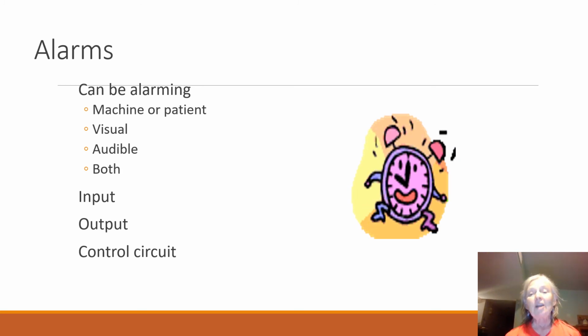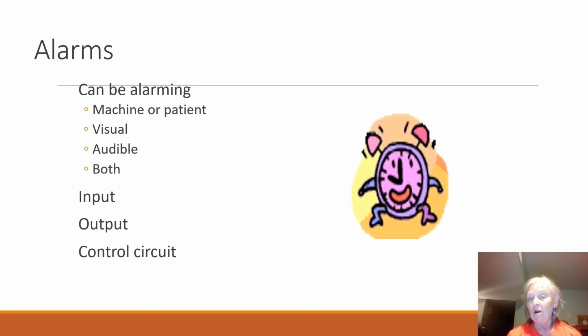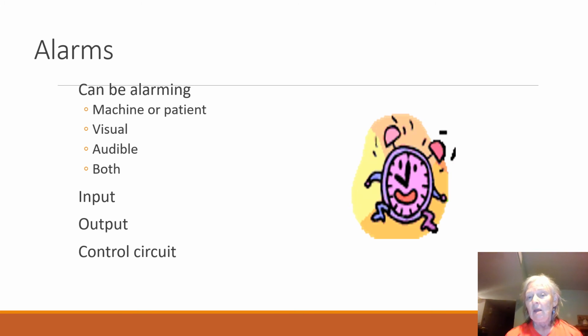There's alarms everywhere. They actually did a study and they said if the alarms were set and delayed by at least 5 seconds, we would not have as many alarms going off and we would get beyond that alarm fatigue. I'm going to tell you, it's always important, if you know that your vent is going off, go and check it.